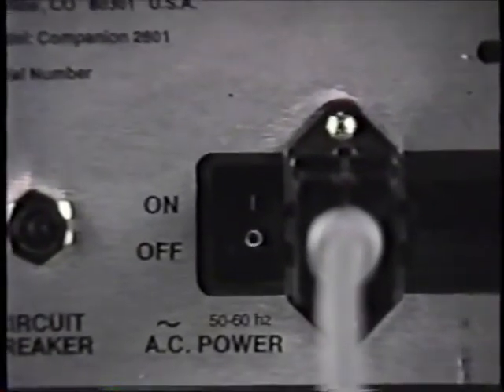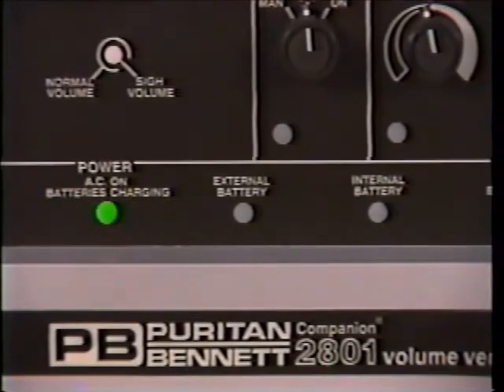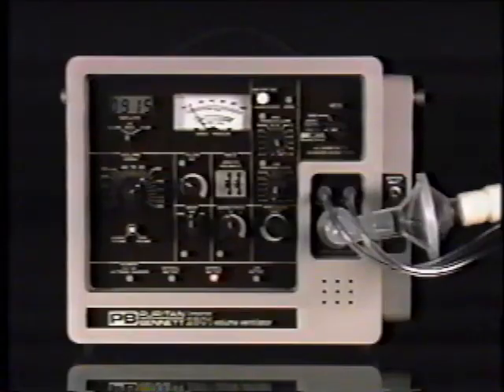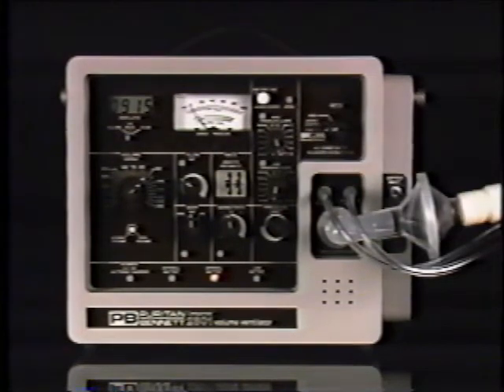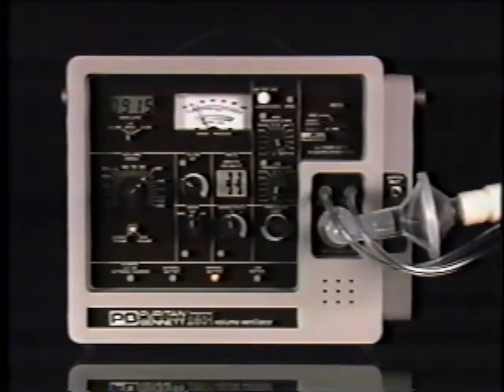The AC power switch located on the rear panel must be turned on to charge the internal and external batteries. Note, the Companion 2801 will operate from its internal battery if the AC power switch is off and no external battery is attached. Operating the ventilator directly from its internal battery will result in a continuous audible alarm that latches on and will need to be reset. This alarm is intended to prevent inadvertent use of the internal battery.